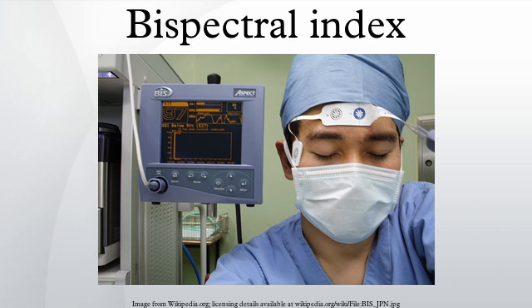A monitor of the autonomic nervous system may be more appropriate for purposely assessing the reaction to noxious stimuli during surgery. However, a monitor of the central nervous system may be more appropriate for monitoring consciousness. After the publication of the B-Aware trial, BIS is suggested as a parameter that allows the anesthetist to reduce the risk of anesthesia awareness during surgery for a high-risk group.